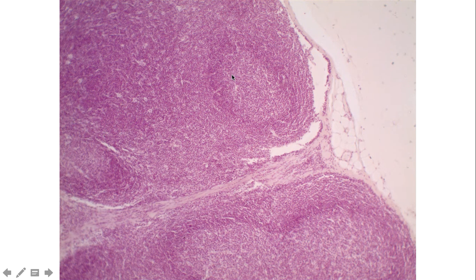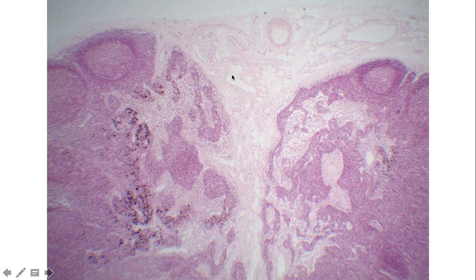And so these lymph follicles, I'm going to go back a slide. Here we can see the outer component of that follicle, and then we see the lighter germinal center. This whole area is composed of B lymphocytes primarily. And these B lymphocytes, because of where they are, are going to potentially be exposed to this lymph fluid. And if there are specific antigens that are non-self, then they would be able to potentially respond to the presence of those antigens and mount an immune response.